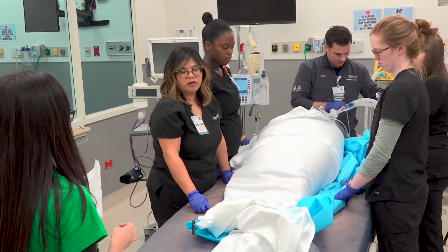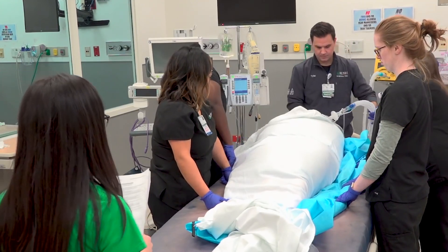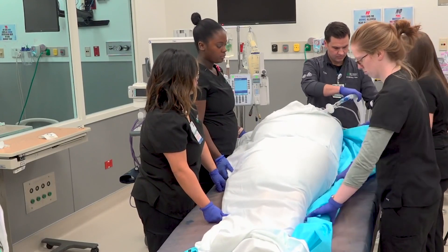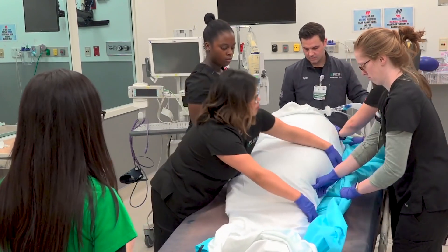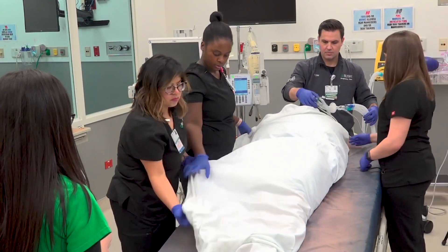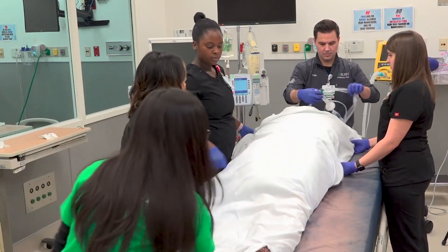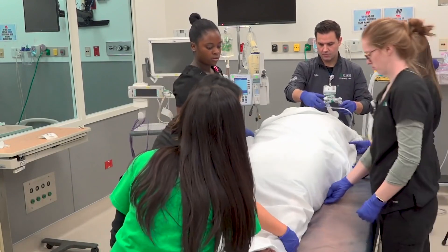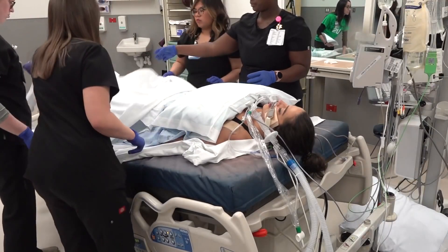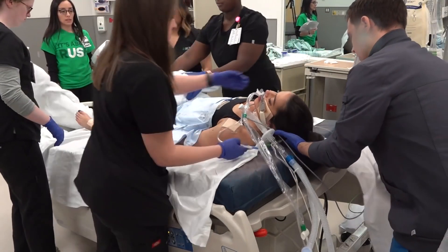This maneuver is done based on the PROSIVA trial: 16 hours the patient remains in the prone position, and 2 to 4 hours the patient is placed back into the supine position. At this time we will assess the patient's arterial blood gas, and if the PF ratio is still 150 or less, we will go through more cycles of pronation and supination.